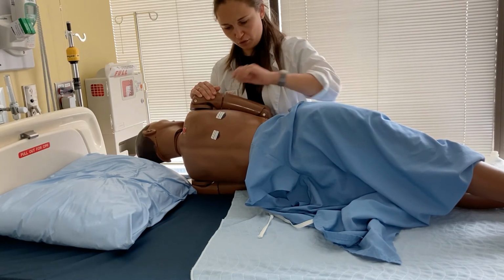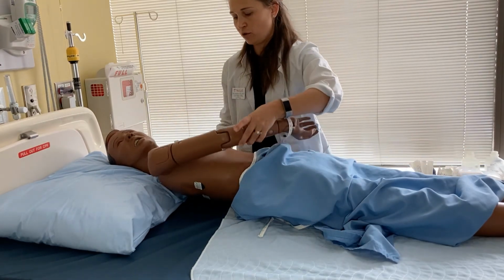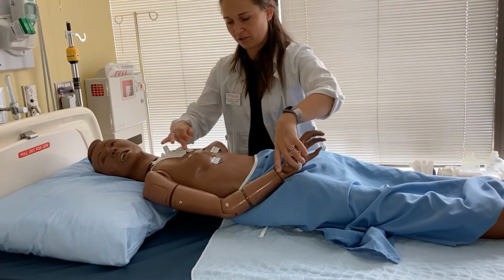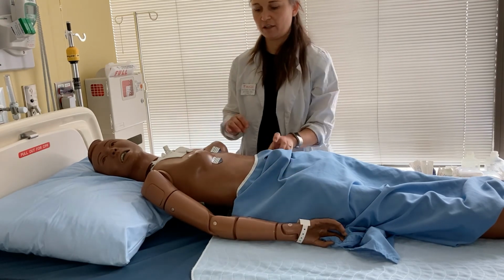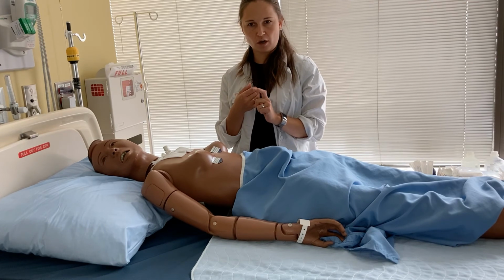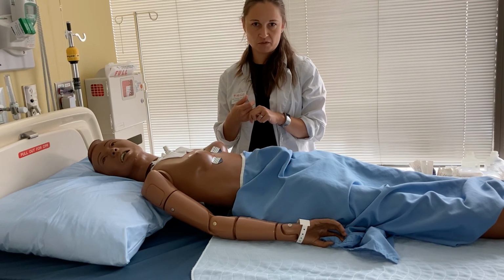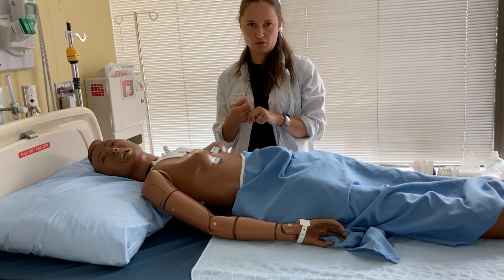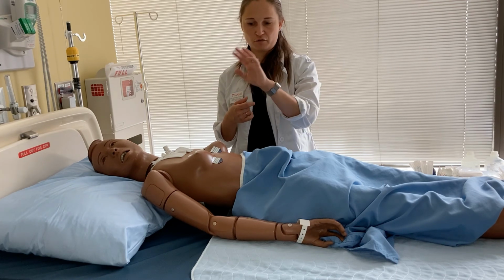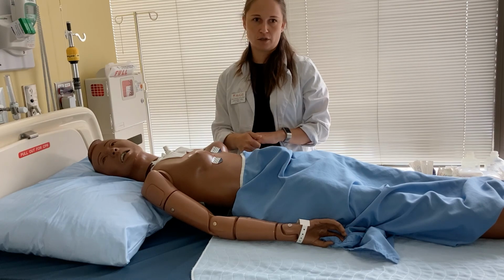So then you would attach your electrodes, and you see that the rest of the stickers I kept as is, and the only stickers that I changed are V4, that becomes V4R, V5, and V6. So V5 becomes V7, and V6 becomes V8. And I will show you on an EKG paper how to change those. After you've repositioned your stickers, you can click EKG and you can print your EKG paper.